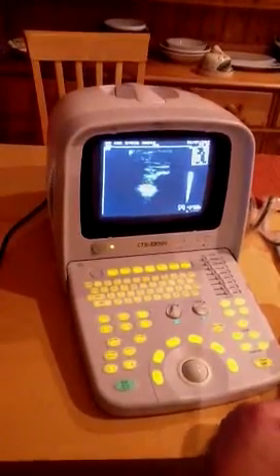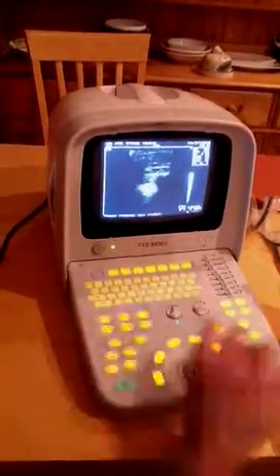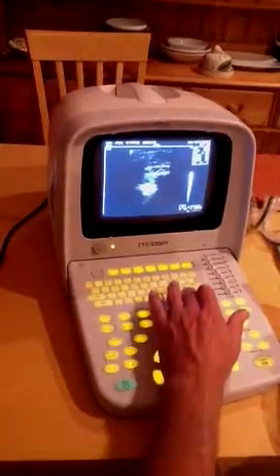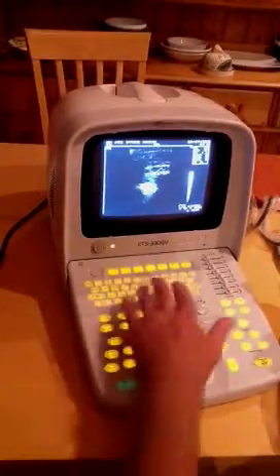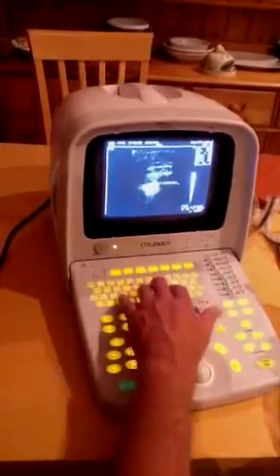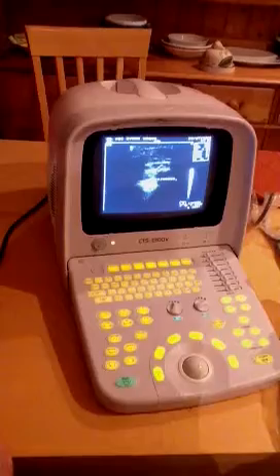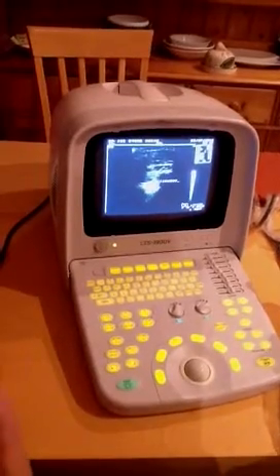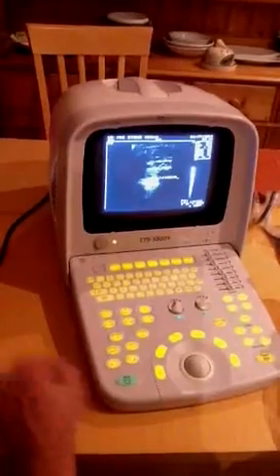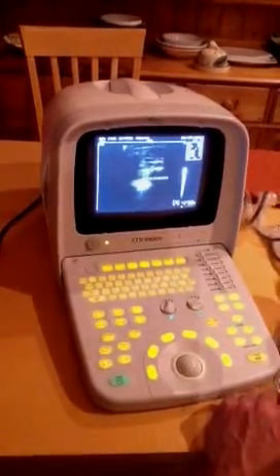If you need to annotate on the image, you press the freeze key first, then press the annotate button, and you can key in whatever information you want regarding that particular image. You can save the annotation together with the cine loop when you save it.